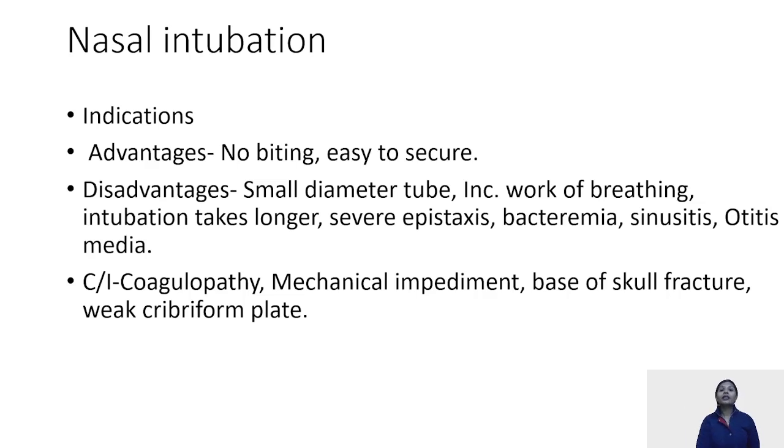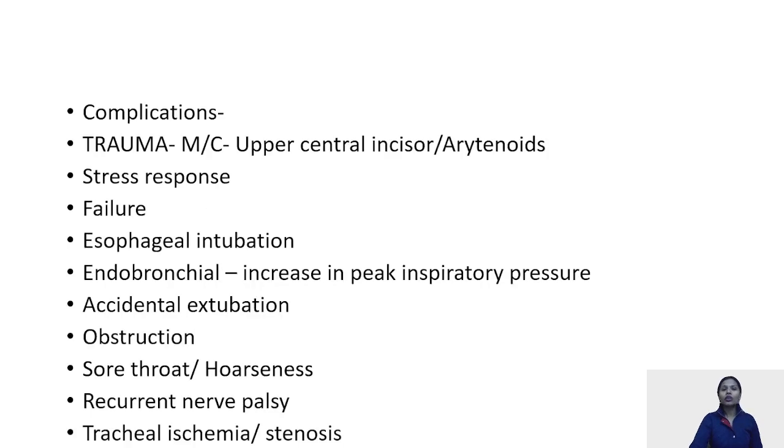Done. The disadvantage of nasal intubation is that generally in nasal intubation we use small diameter tubes. And as I've already told, according to Hagen-Poiseuille's law, the lesser the diameter, the more the resistance, and thus the work of breathing increases. Then intubation via the nasal route takes a little longer.